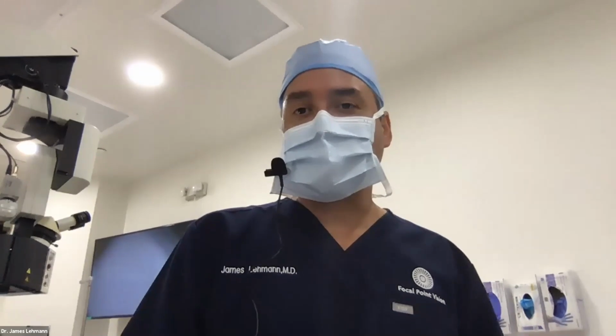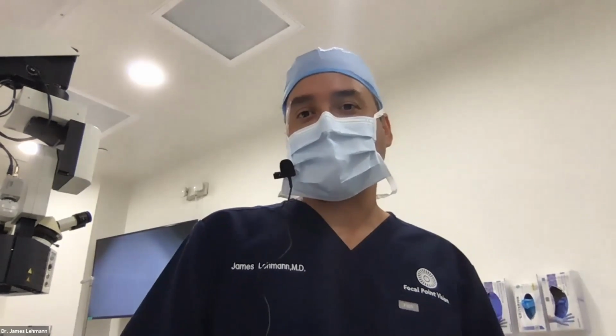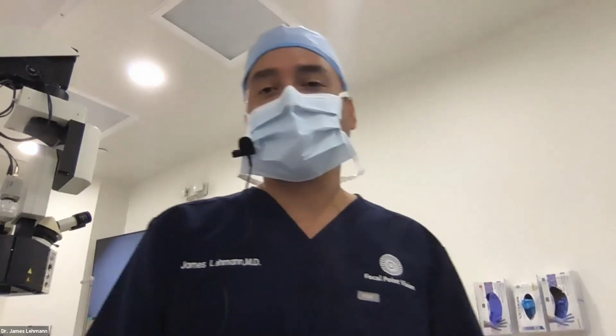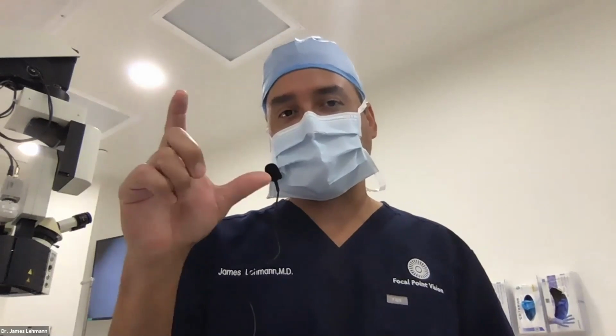What was the purpose, Dr. I can't read it because it's in Cyrillic writing. Anna something or other. Komarab something. What was the purpose of introducing blue dye in the first operation? It was just to show you all. I wouldn't do it normally. It was so that you could see that the laser made a nice capsulotomy.